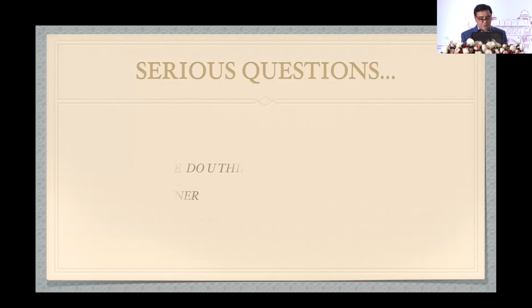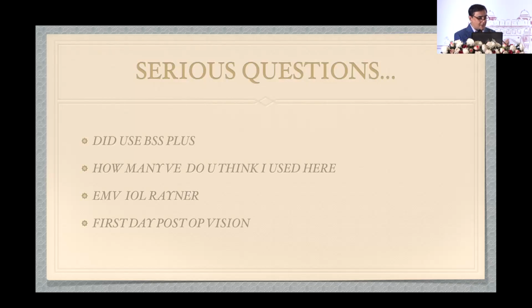So now serious questions. How much BSS do you think I used? I used 1.5 bottles. How many viscoelastics do you think I used?